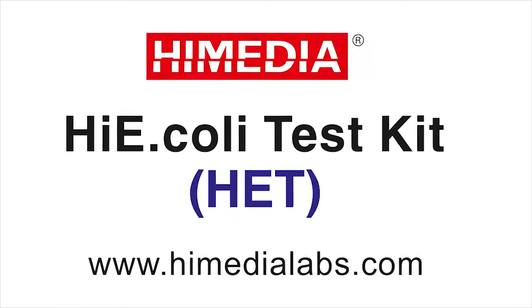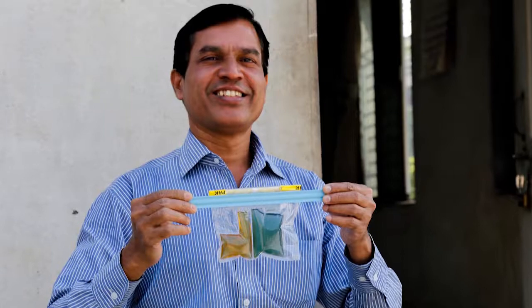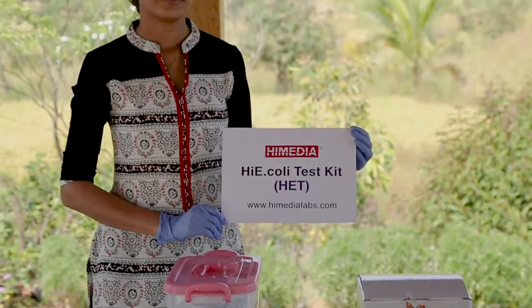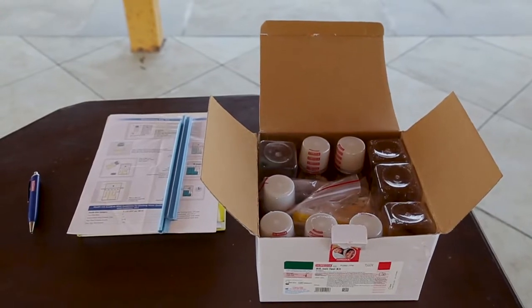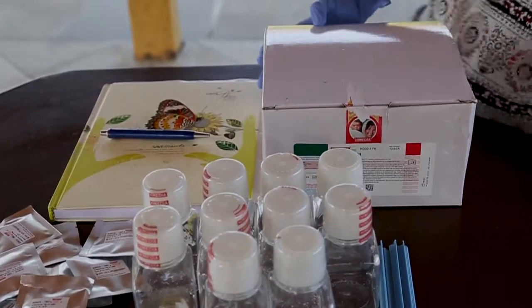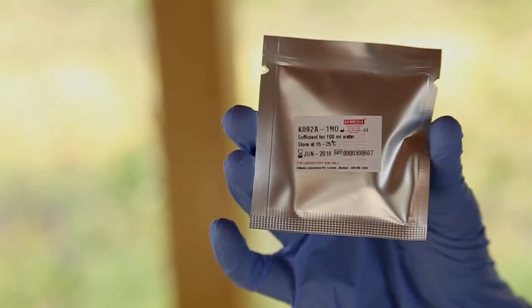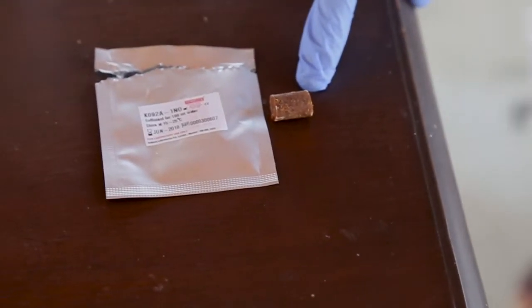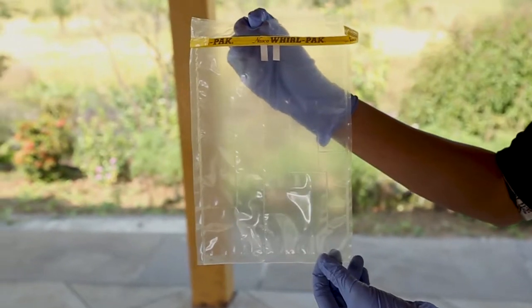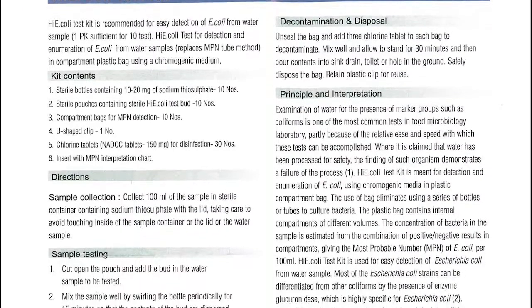The High Media High E. coli Test Kit lets anyone anywhere test drinking water for E. coli bacteria and monitor water quality. Portable, compact and self-contained, the compartment bag test known as the High E. coli Test comes in a kit which includes a complete supply for 10 tests: 10 bags, 10 100-milliliter sample bottles containing sodium thiosulphate, 10 High E. coli medium test buds inside carriers, chlorine tablets for sample disinfection and safe disposal, a reusable seal clip for safe transport of bags, and an instruction sheet.